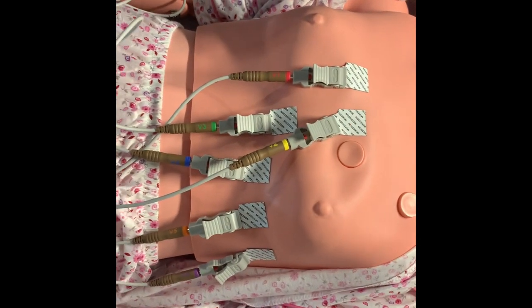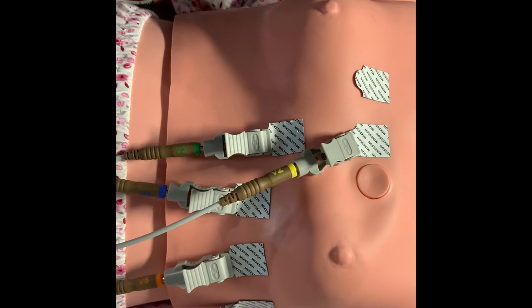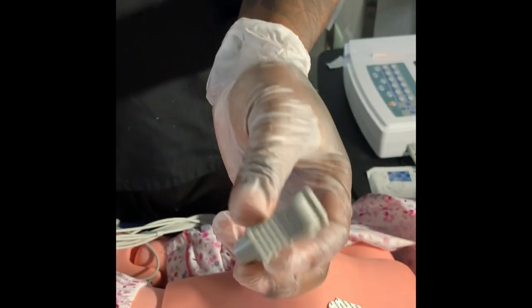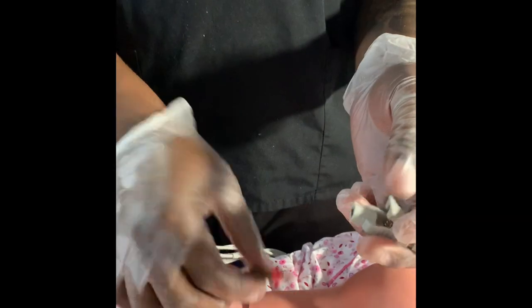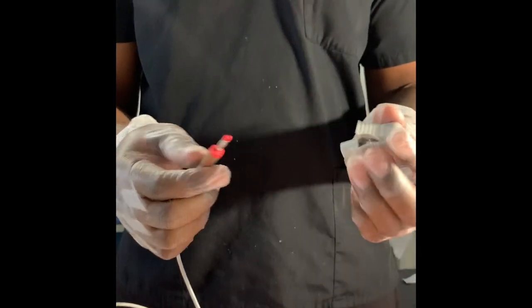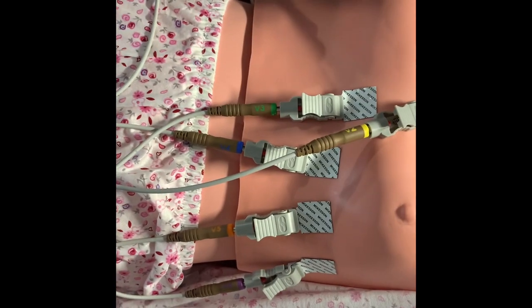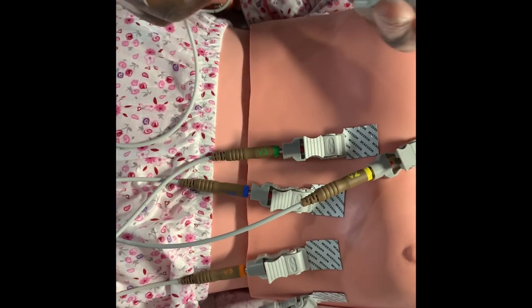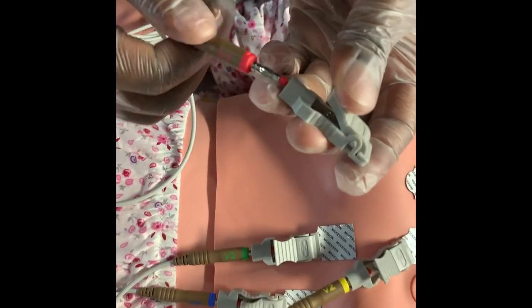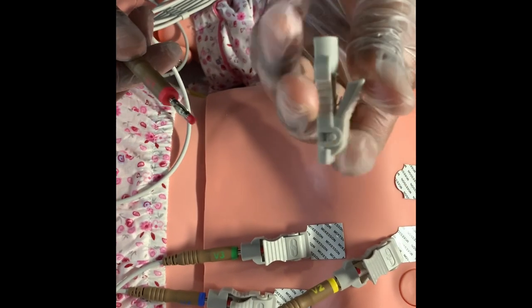This is called an alligator clip. A lot of times when you're working at hospitals or clinics, this might break and snap off — you want to make sure you just get a new alligator clip from wherever they keep it and connect it back to the lead. These are not disposable, so don't toss them out after every patient. You can wipe them down with disinfectant wipes. Unless it has blood or vomit or something like that, you don't have to throw it out. If they do break, just make sure you get a new one.